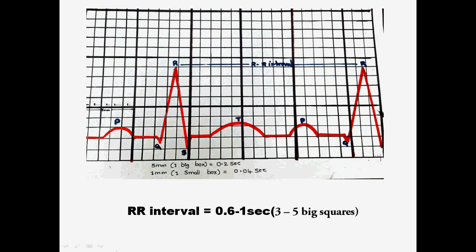As the RR interval needs the electrical activity of two cardiac cycles, RR interval is the time between two R waves. The normal duration varies from 0.6 to 1 second, that is it varies from 3 to 5 full big squares. An interesting fact of the RR interval is that we can calculate the heart beat by counting the number of small squares between two R waves.